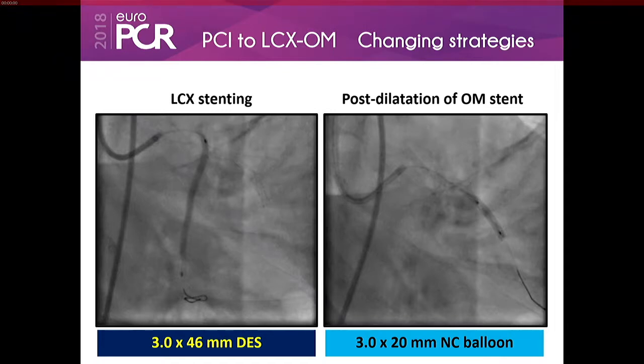So here you size it to the proximal vessel, which is bigger. You keep the distal end of the balloon marker proximal to the carina. So you put your POT with the distal marker proximal to the carina, and it is said, and again, lots of thinking about it, but I'm not sure if I would buy this every time, that when you do that, you open up the struts here so that your wire can cross easier. Okay? So that's the rationale of a POT. Two things. One is to optimize the proximal, and two, to facilitate the entry into the side branch.